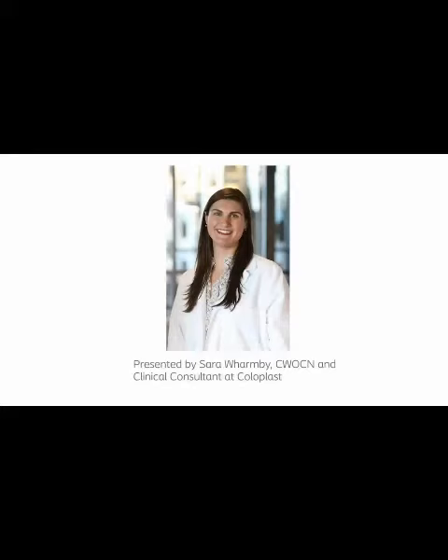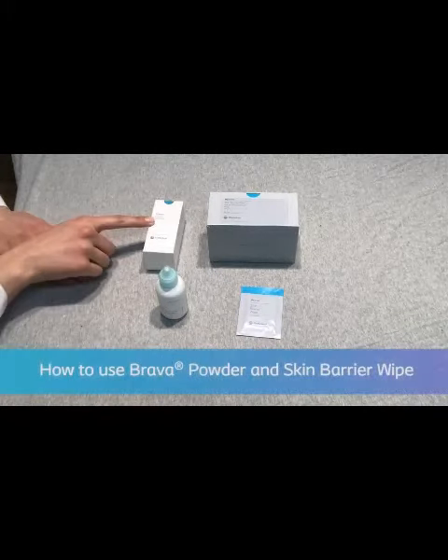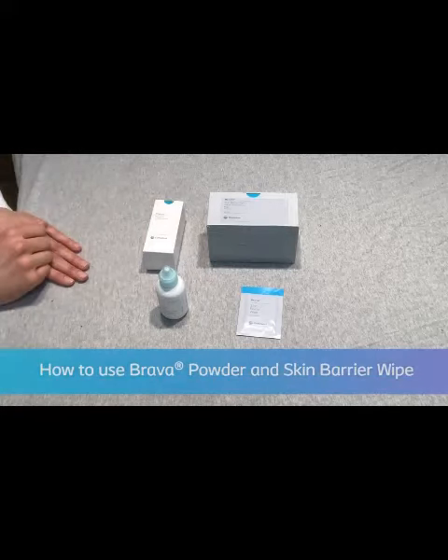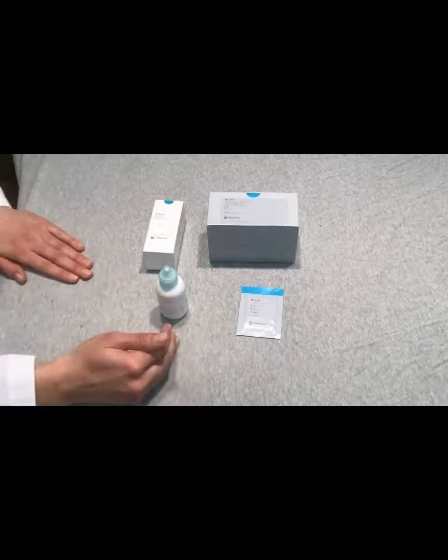Hello, my name is Sarah Warmby. I'm a certified wound ostomy continence nurse and clinical consultant with Coloplast. This module will include how to use the Brava powder and the Brava skin barrier wipe, which is typically used in conjunction with each other.